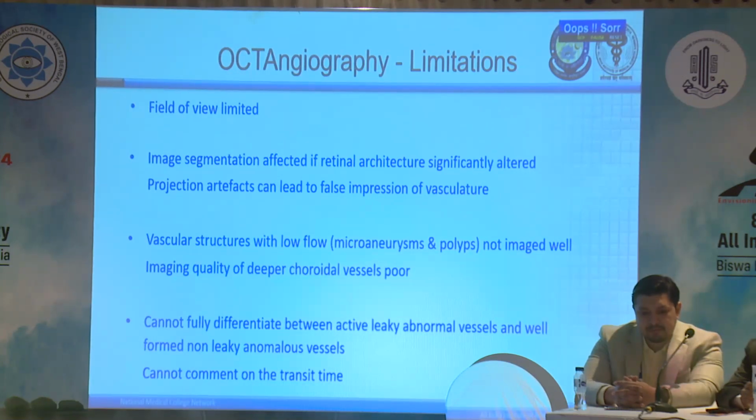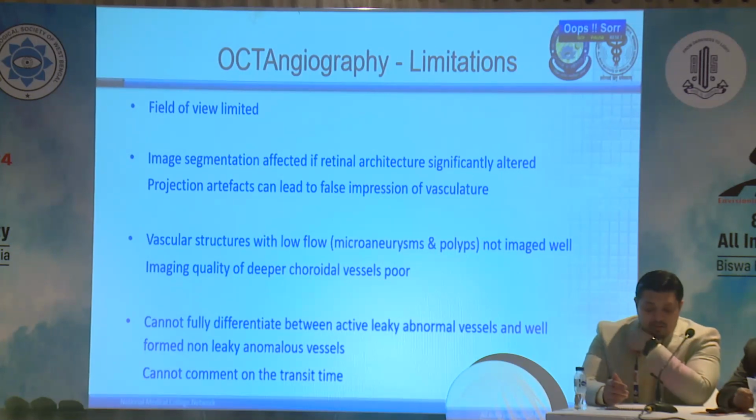Then the vascular structures with low flow, such as microaneurysms and polyps, may not be imaged well, and they may be missed, and you may not be able to differentiate between leaky as well as non-leaky abnormal vessels, and cannot comment on the transit time in OCT angiography.